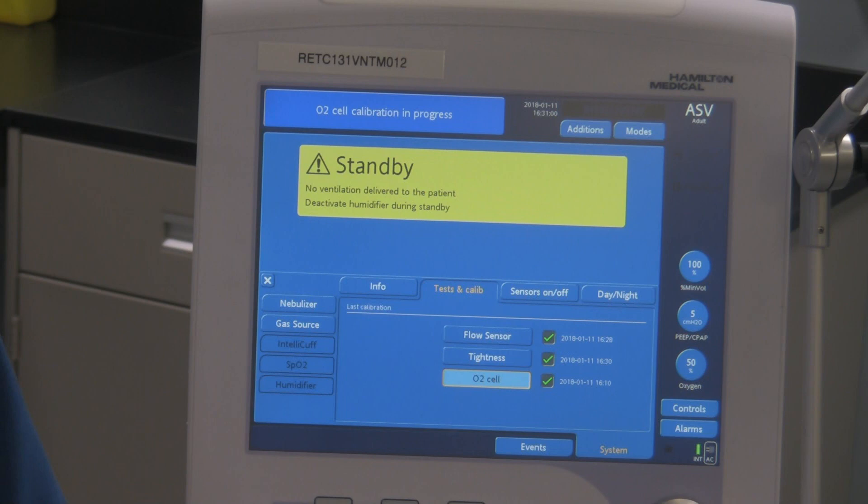A couple other things: make sure that when your ventilators, after you've done the pre-use checks, if you're not using it right away, make sure the circuits are capped off so no dust gets in them. It's probably a good idea to put something over the ventilator to keep it clean until it's ready to be used. Make sure you've got your wheels locked before you do your pre-use checks, and the wheels should be locked when the ventilator is at the patient's bedside as well. Still waiting for that O2 cell calibration in progress to finish — it is taking a bit more time, so there's a good chance this fuel cell is getting old.